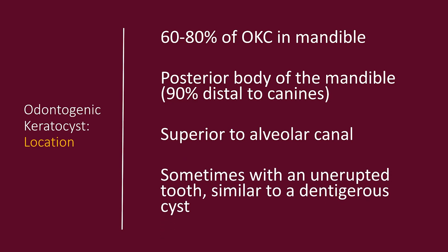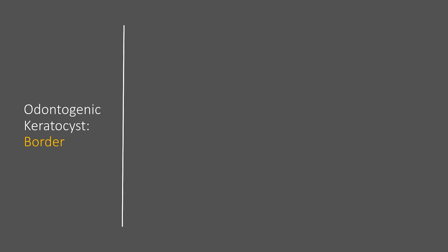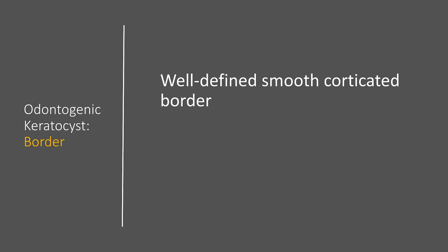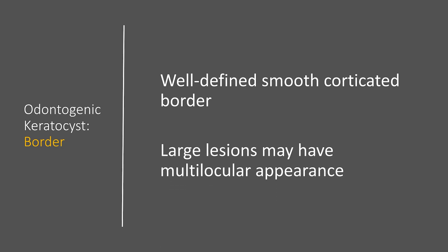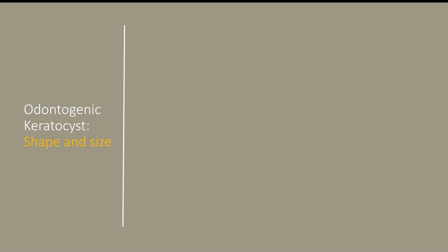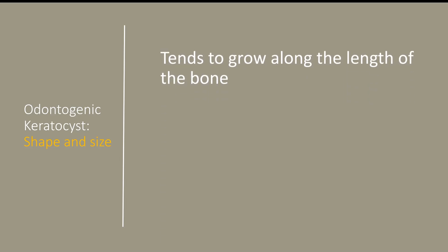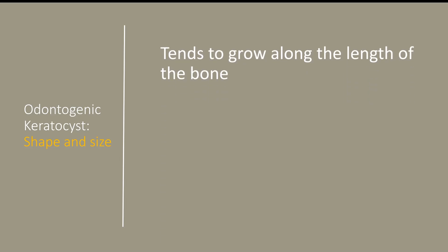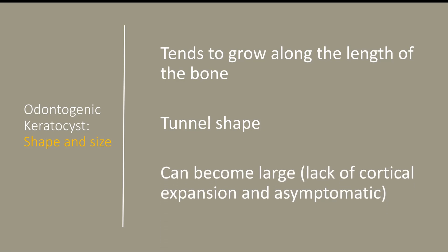Sometimes these are associated with an unerupted tooth and may look like a dentigerous cyst. The border of the odontogenic keratocyst is often well-defined, smooth, and corticated. Large lesions may have a multilocular appearance. The shape can be circular, but it tends to grow along the length of the bone — this is what we saw in our case. This lesion was rather elongated than a hydraulic circular shape. Often we see the tunnel shape, and it did not expand the cortical plates, so it can become fairly large. The lack of cortical expansion and the asymptomatic nature may allow this lesion to grow for quite some time before it is detected.